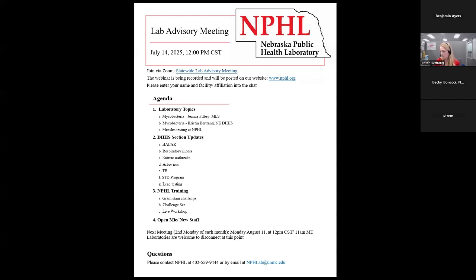We didn't talk too much about our MDDR testing or rapid drug susceptibility testing. If we have someone that we suspect is going to be drug resistant, maybe an exposure, or we have suspicion that they're a contact to someone with drug resistant TB, that is an option, and that is a clinician order, or we can suggest it from the state level to the clinician to make sure it happens. The genotyping is quite helpful for contact tracing, to link cases, to help our contact investigation. So you may get a call from me at your lab if you do have a culture growing, and we do need to ship it back to NPHL so they can send it out to Michigan.